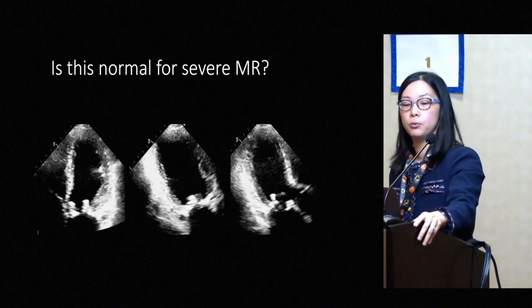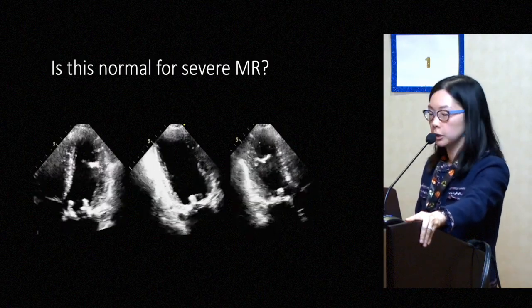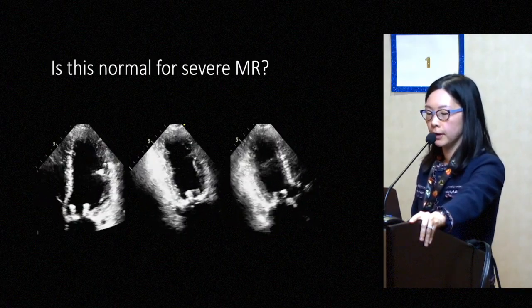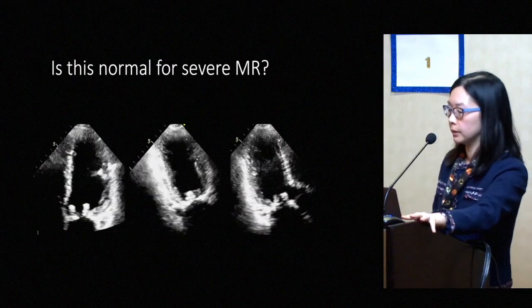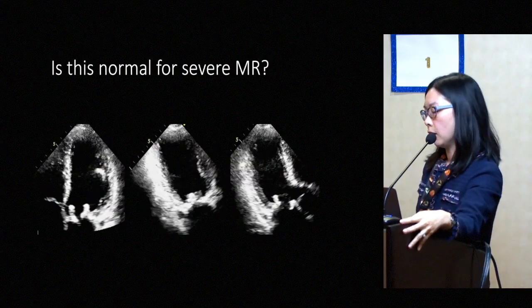And then one final point that I think is forgotten a lot of the time when we get excited by these new technologies is the LV function, especially for the mitral valve. This is a patient who had a mitral valve, and it's actually quite normal, maybe not quite hyperdynamic as you would like. One of the things you have to remember is that LV size and function measurements aren't very reliable in severe mitral regurgitation because of the offload.